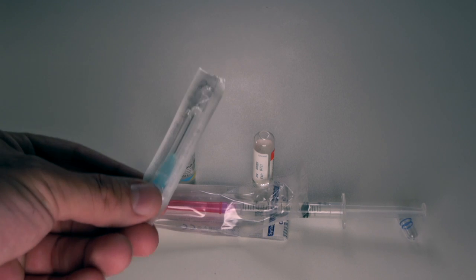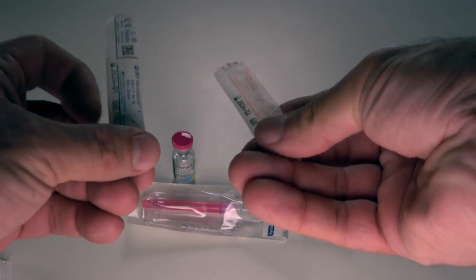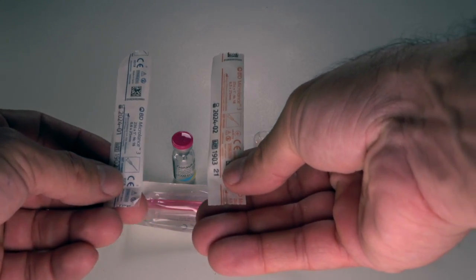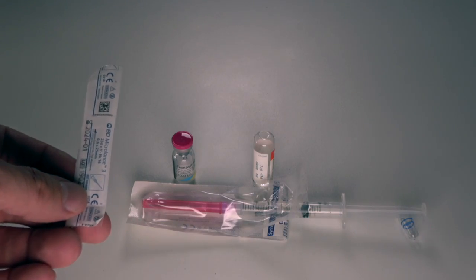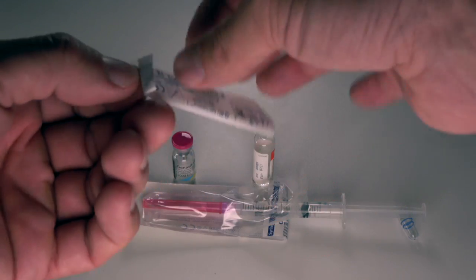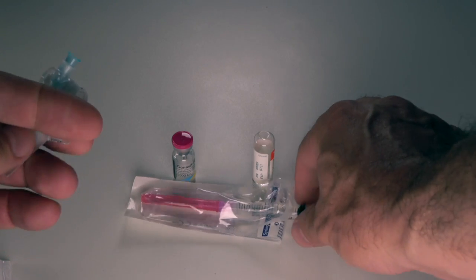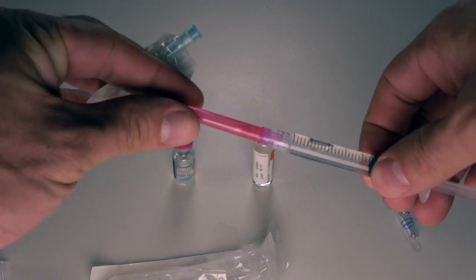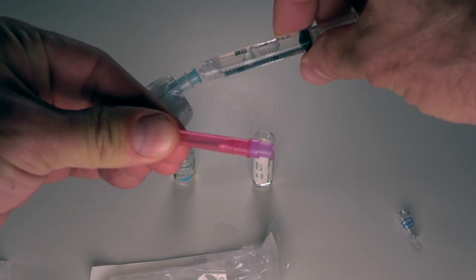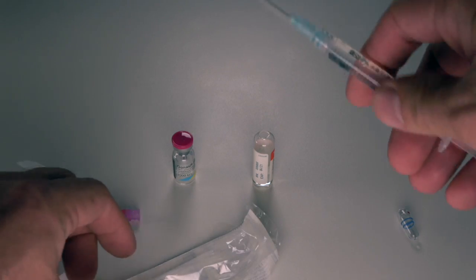You'll now need to choose which needle to use for injecting saline — either the 23-gauge or the 25-gauge. I've chosen the 23-gauge, which is what I usually have around. Open it carefully, making sure not to touch any parts of the opening of the needle. Replace the needle filter with this smaller, thinner needle for inserting saline into the HCG vial, then put the filter needle back in its packaging for safe keeping.